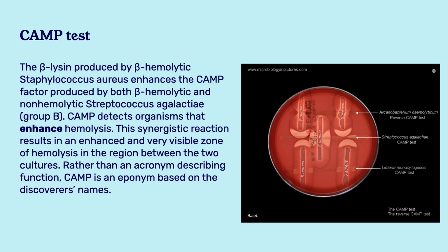It should be noted that, rather than being an acronym describing function, CAMP is an eponym based on the discoverers' names, Christie, Atkins, and Munch-Petersen.